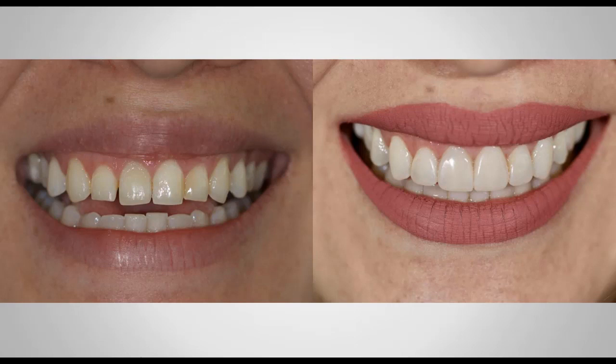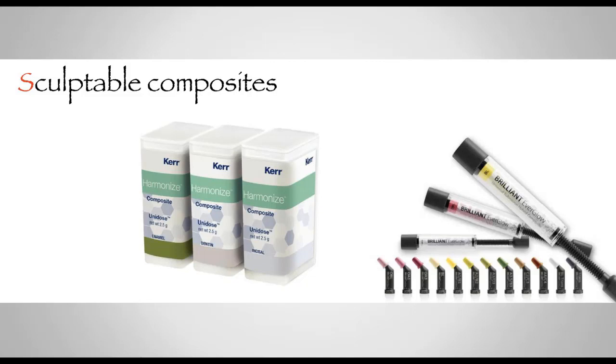They're able to have a normal conversation. They're able to show them to other people around them, to help them evaluate if this is what they're looking for. And at the same time, one more thing that these prototypes are good for is that once I'm ready to do my porcelain veneers or any type of restoration that we're going to fabricate for a patient, in this particular case, the indication for this patient is going to be porcelain veneers, you're going to use these prototypes as your preparation guide. You're going to prep through them, and then you're going to analyze and calibrate how much tooth structure, if at all, needs to be removed. And again, I'll share with you a full case so that it will be easier for you to understand.